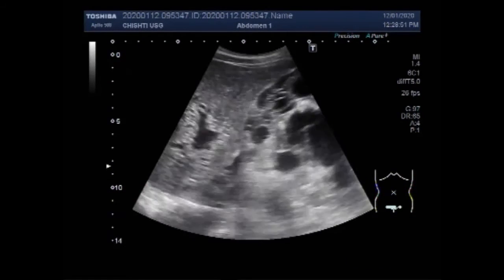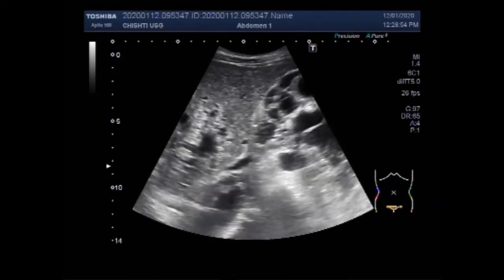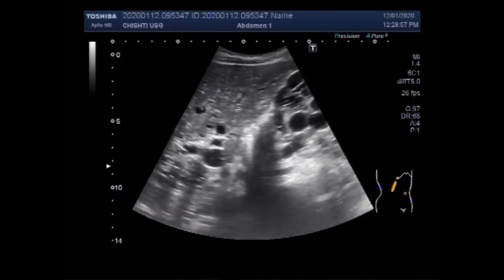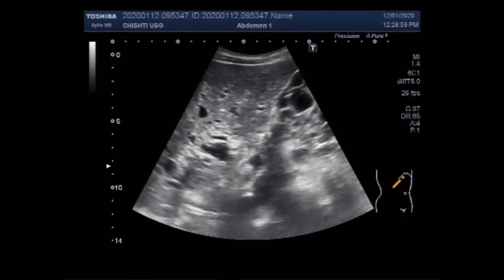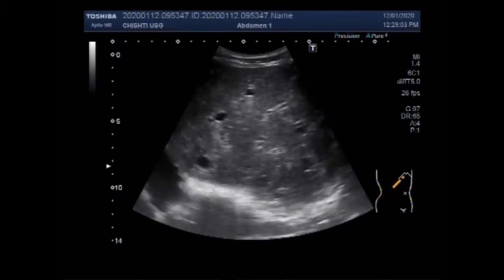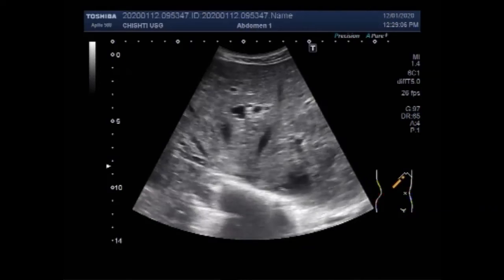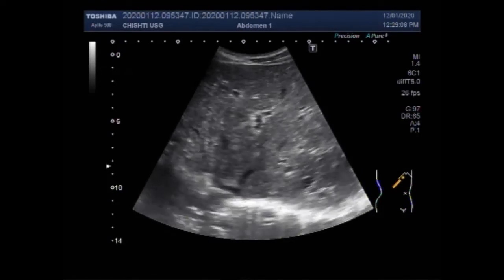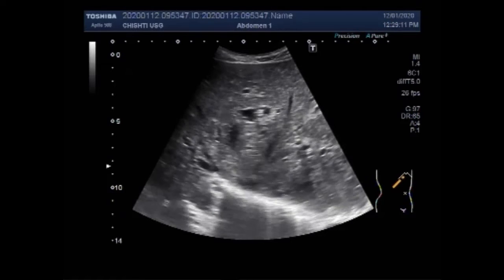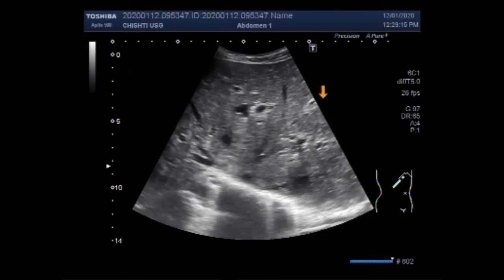Dear viewers, I hope you are all fine. This ultrasound video shows polycystic liver disease, which is a genetic disease. The most common occurrence of polycystic liver disease is associated with autosomal dominant polycystic kidney disease, ADPKD, where cysts are seen both in the liver and the kidneys.